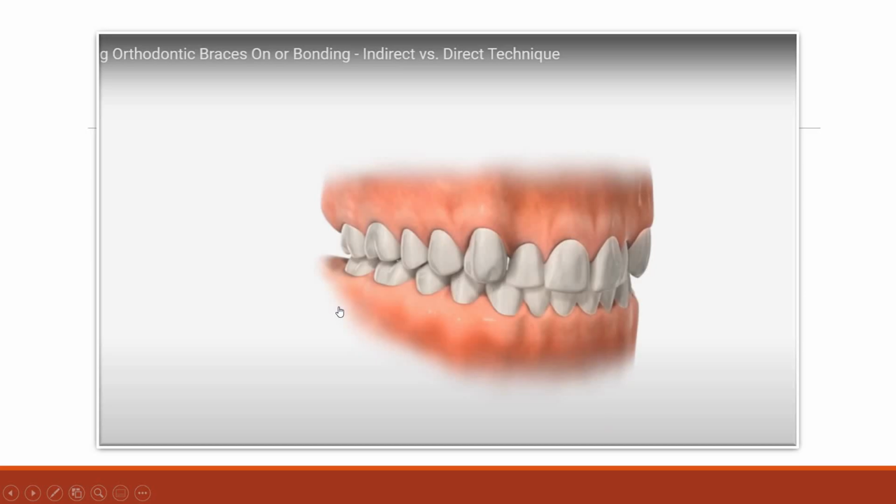So you can say that Dr. Edward Hartley Angle, father of modern orthodontics, contributed not only to classification and diagnosis, but also to developing new orthodontic appliances. In 1887, he created the Angle system, which ultimately would result in the introduction of the edgewise multibanded appliance in 1928. With few exceptions, contemporary edgewise appliances are based on Angle's design from the early 20th century.